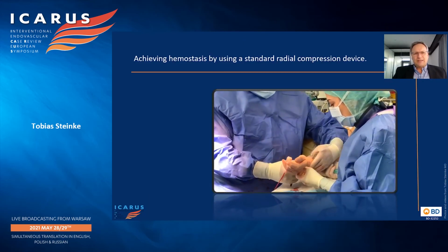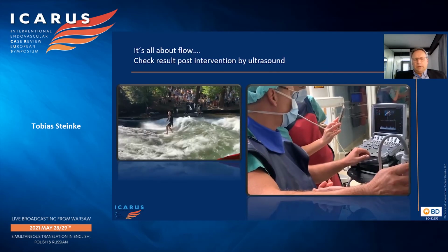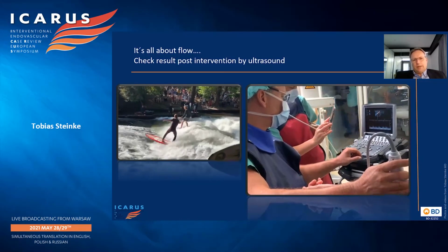Achieving hemostasis by using a standard radial compression device. We know it's all about flow, so we always check the result post-intervention by ultrasound.